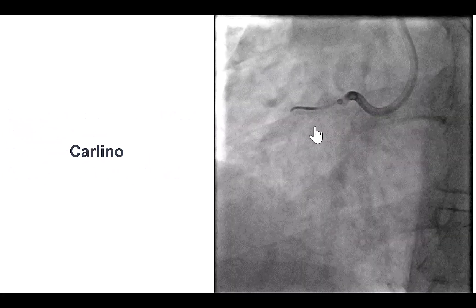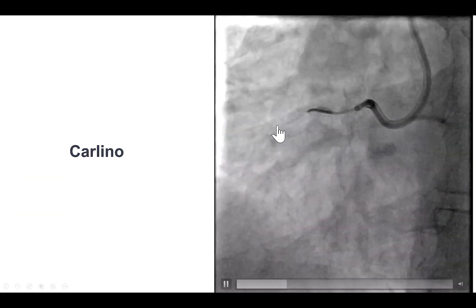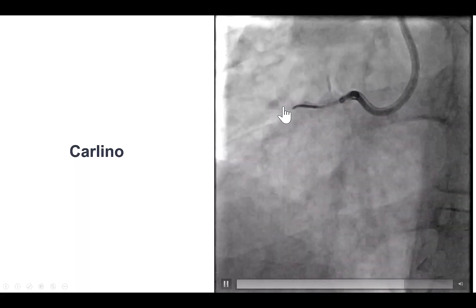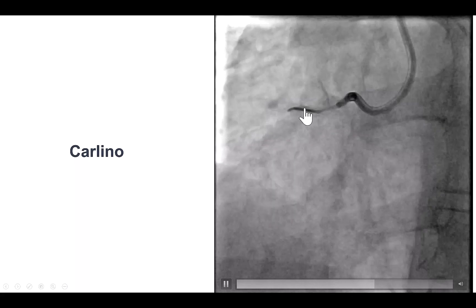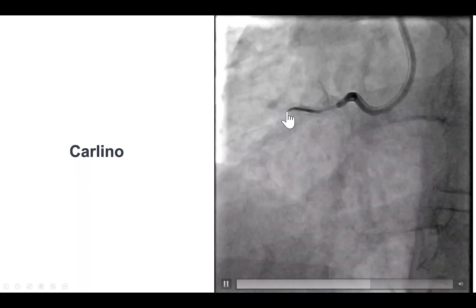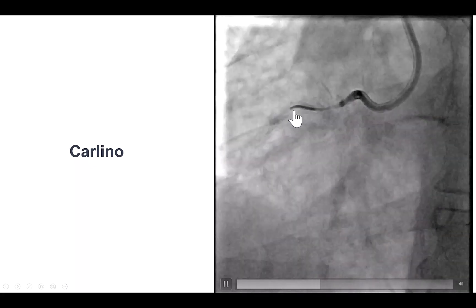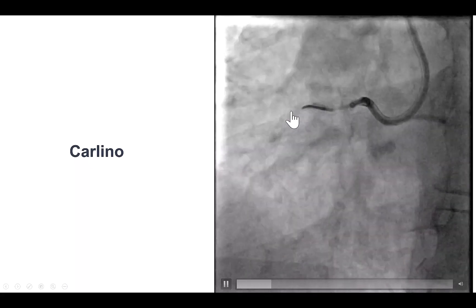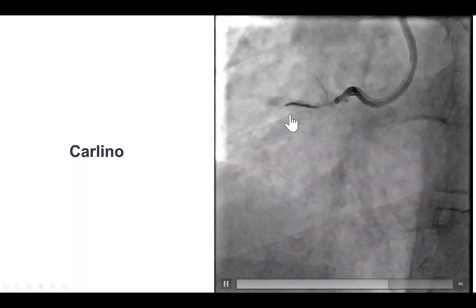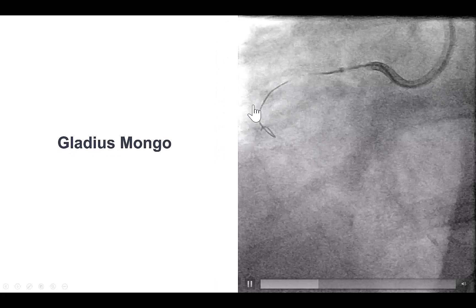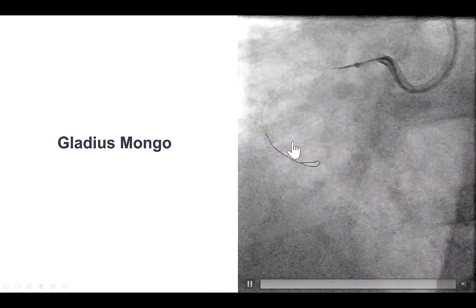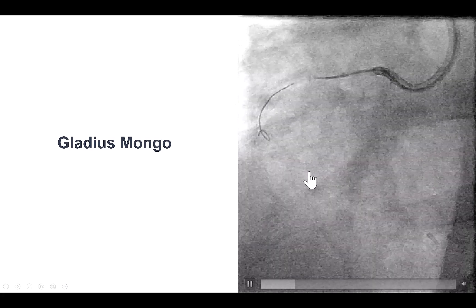Microcatheter and tri-wires were not successful. There was an area that was very hard to penetrate. One solution for such lesions is the Carlino technique — we advanced the microcatheter as far inside the lesion as possible and then performed injection of a small amount of contrast, less than 1 cc. After doing that, we were able to knuckle a Gladius Mongo guide wire that went around the lesion and appeared to advance along the course of the vessel.